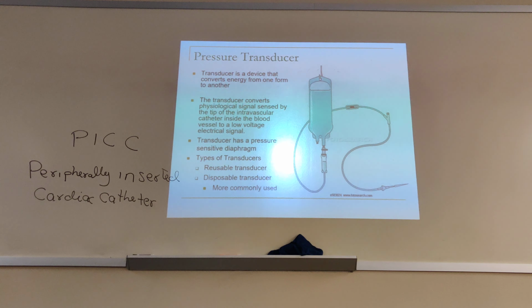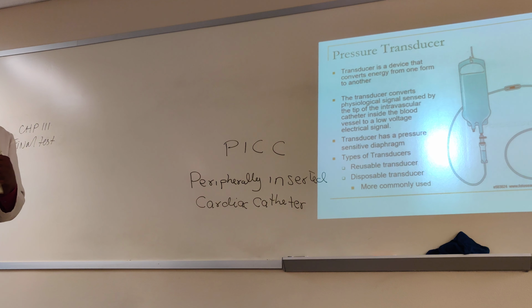The more the diaphragm is displaced, the higher the pressure, meaning more pressure is coming up. The less the diaphragm is pushed, the less pressure will be read out on the monitor. So if your diaphragm is messed up, you're not going to get accurate pressure because it's not sensing the pressure very well.